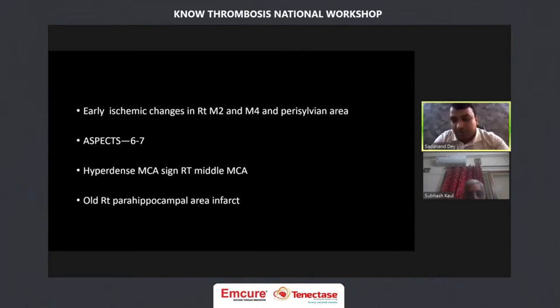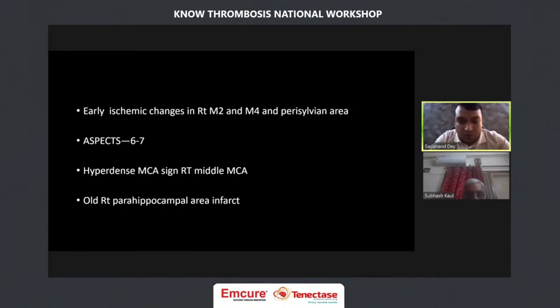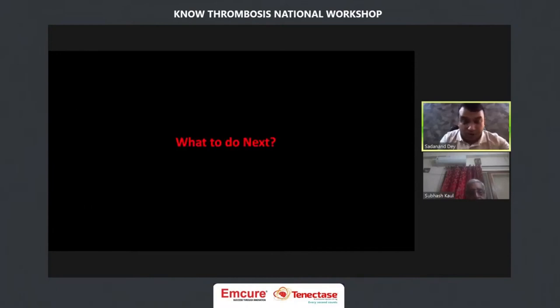Early ischemic changes were in right M2, M4, and the perisylvian area. We estimated ASPECTS around 6 to 7, and there was a hyperdense MCA sign. There was also an old right parahippocampal area hypodensity, probably an old infarct. However, when we inquired, the family was not very sure, so we were uncertain whether that was symptomatic or not.